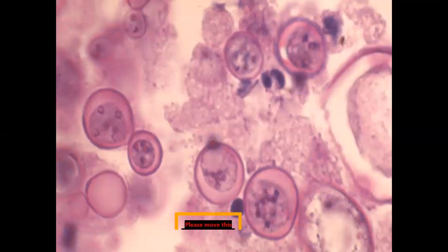There is broad based budding seen, and this is a hematoxylin eosin preparation. You have to take sputum, or a lung washing or a lung lavage through a bronchoscope as a specimen. You can see it on the slide, you can stain it with special stains like silver staining, and you can just see the fungus. You don't have to go for cultures even.